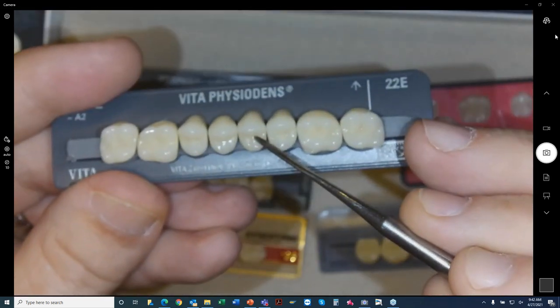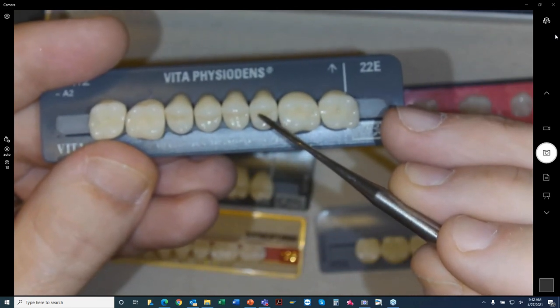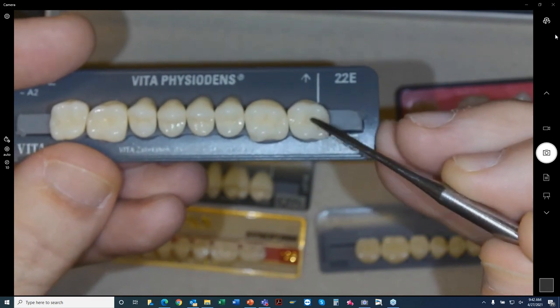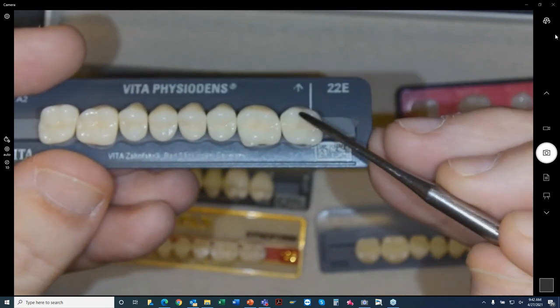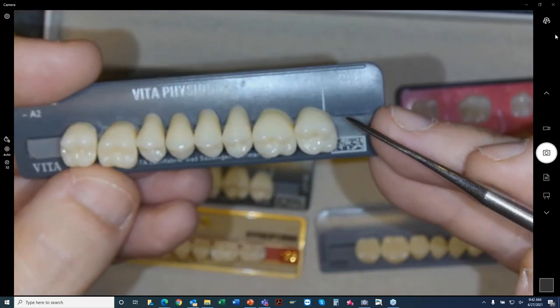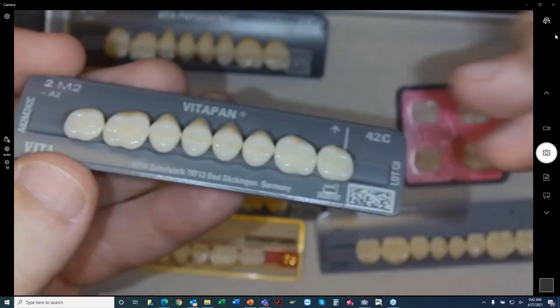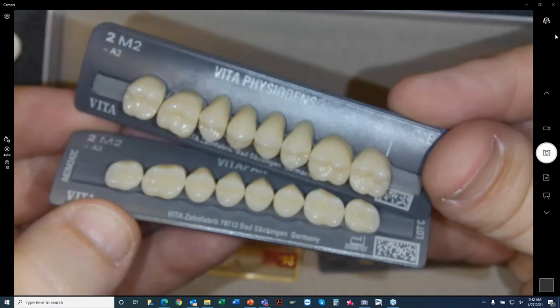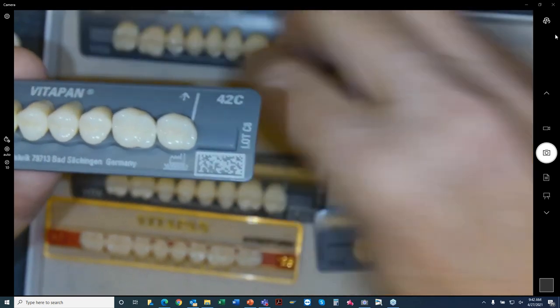They start at 33 degrees, and then, like natural teeth, they slowly shallow out to 28. So from 33, shallowing out to a 28 degree angle inclination. Very natural posterior looking tooth. You've got the cuspy forms, a little bit shallower as far as the width goes, and they have very nice anatomy.